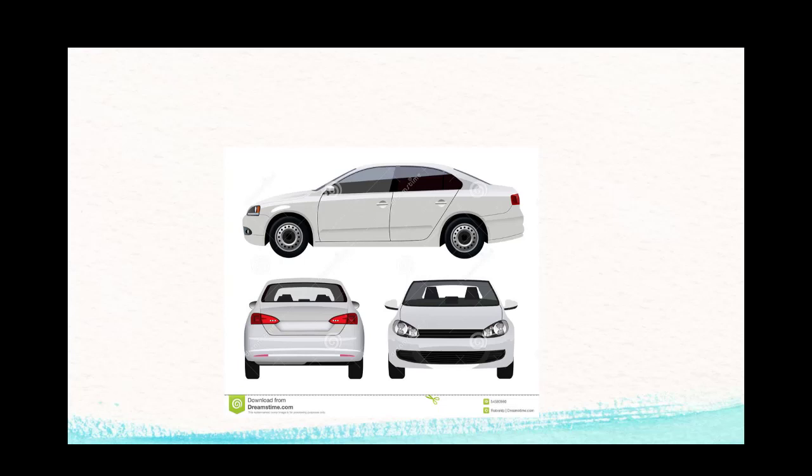So if I have a cardiac lead that's looking at the top part of the heart, it can't see the bottom part. We know it's still there, just like we know that passenger door is still there, but you just can't see it from that vantage point. So if you look at the lead that's looking at the bottom part of the heart, then you'll be able to see that part, but it doesn't give you information on what's going on in the top part of the heart. Just like looking at the passenger door, we won't see that big scratch on the driver's door.